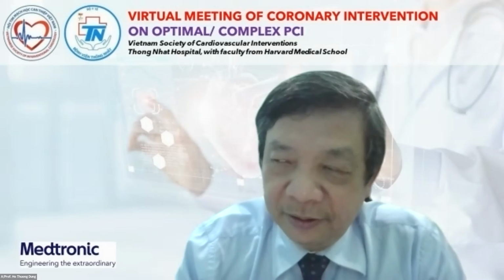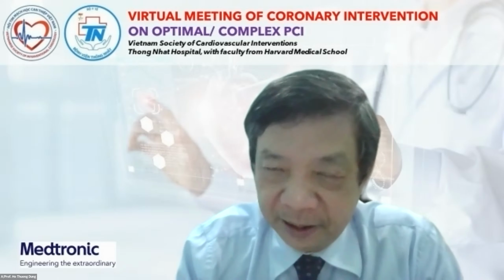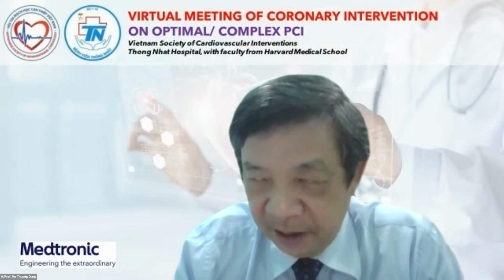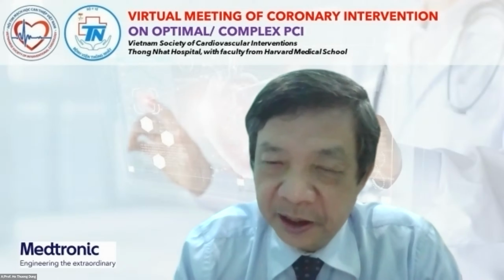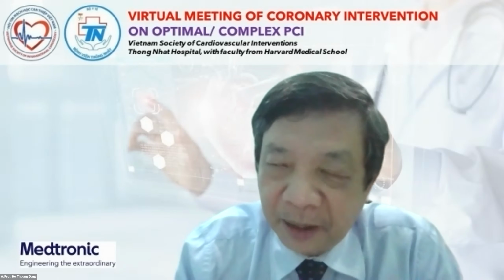Professor Nguyễn Văn Tân, are you there? Yes, I'm here. Yeah, teacher, I'm here. I know you have some 5-10K cases at your hospital, with cardiac arrest, primary PCI for STEMI. And when you do STEMI in this situation, some patients need mechanical circulatory support. So what is your opinion about the balloon pump?